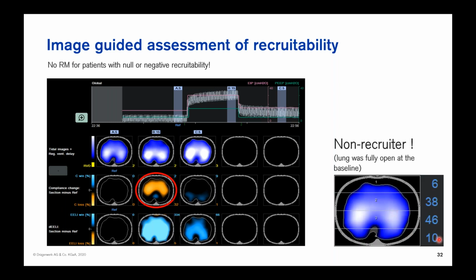And then, as I mentioned on the slide before, if you determine that there is a patient that has a ventilation distribution of 10% or even more, then those patients do not have to be considered for conducting a lung recruitment maneuver. And at the same time, I would also not recommend, or I would predict that it's not beneficial, to do prone positioning in these kinds of patients.